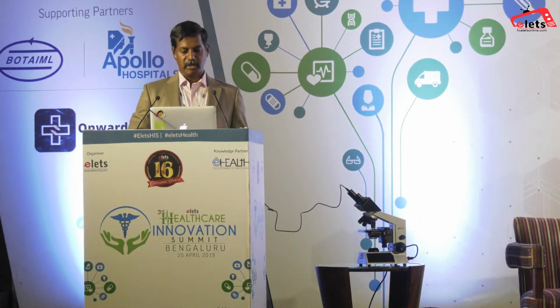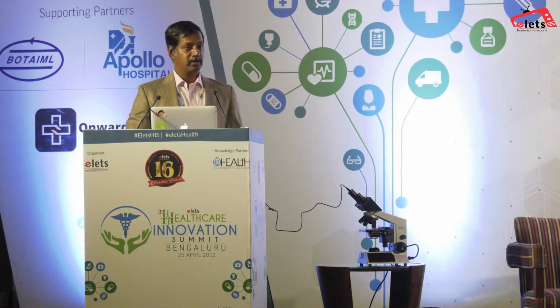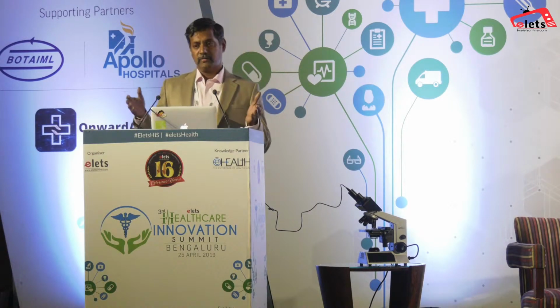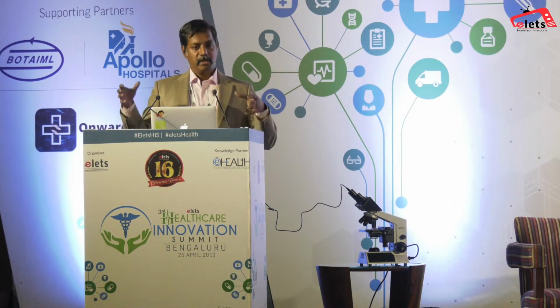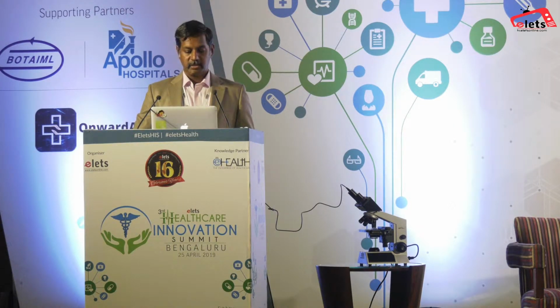In this case, I have a sample that we've uploaded, and once that is done, we can upload images right from here. In case you have digital pathology or a WSI where you have captured images, or using a trinocular, you can upload your slide images here, or we also have something called a live capture.